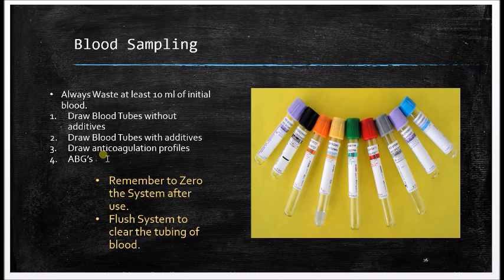Always remember to zero your system after you use it. Don't just turn the stopcock back to the atmosphere and let the system run. Make sure you zero the system and flush the tubing to ensure that the art line remains patent for the next time you need blood.